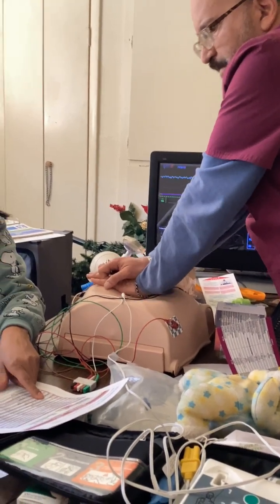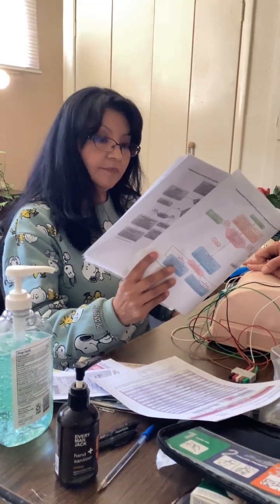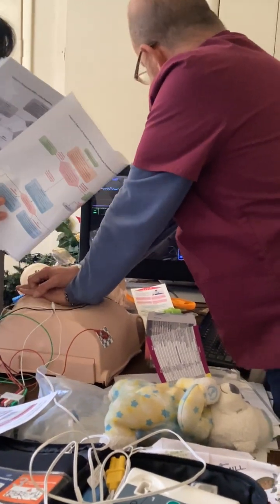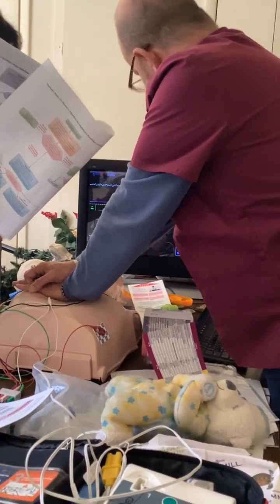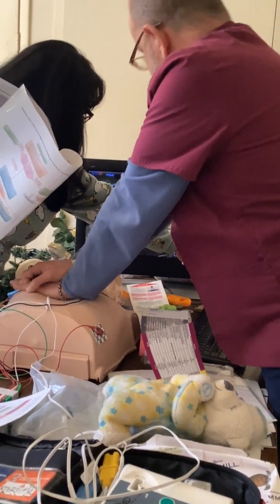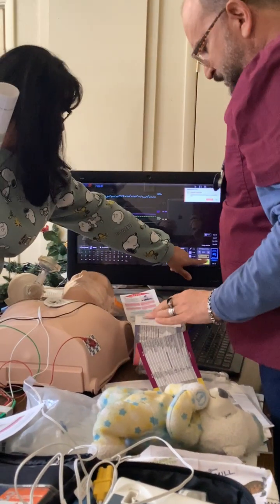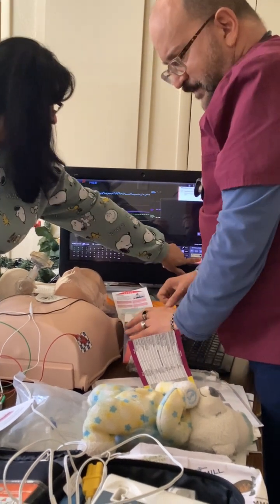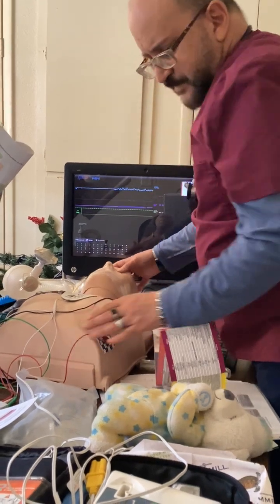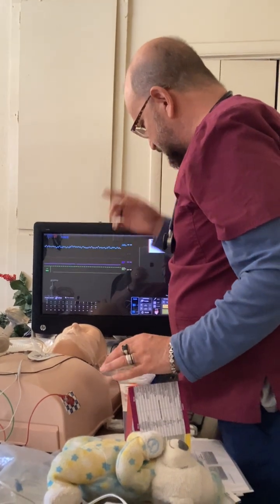And according to the algorithm, do another shot. I'm tired. Okay, so we'll switch. So we'll stay at that. Okay, now charge. Clear, everybody clear? So we're continuing CPR. I don't know where the ET tube is, but it got buried somewhere. But when we do the test off, I'll show it to you.